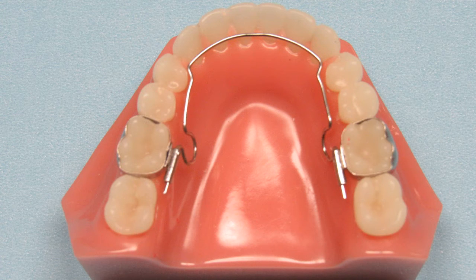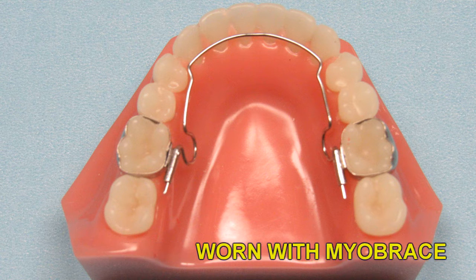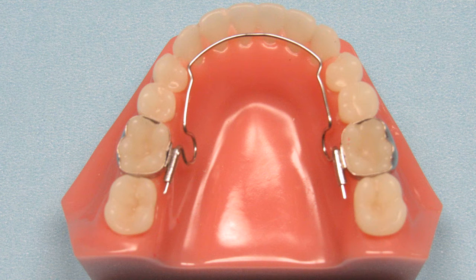As an added bonus, the patient can wear any of the Myobrace appliances over the BWS to help speed up treatment and quickly form the arches. This allows you to push from the lingual with the BWS while you align the teeth with the Myobrace appliances.